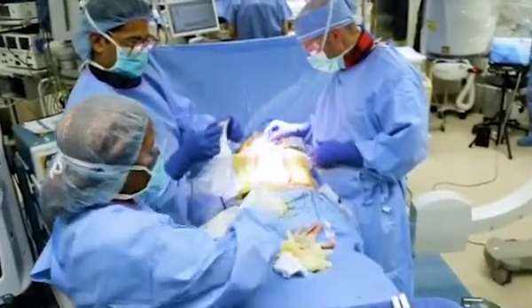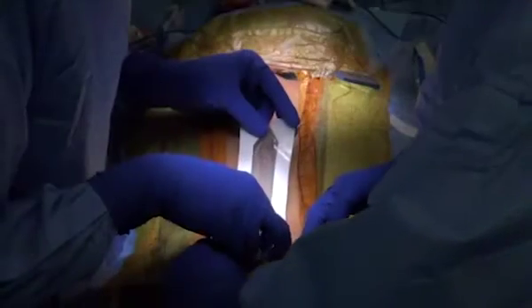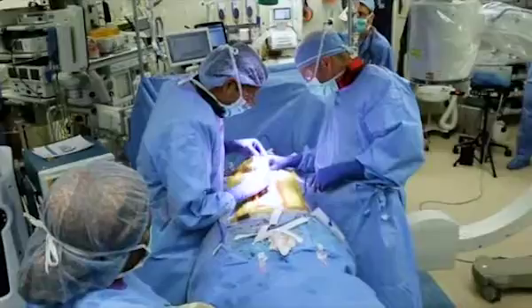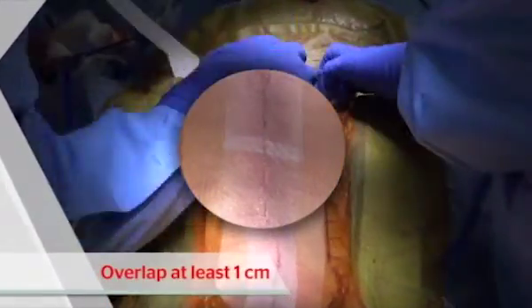Applying Dermagon Prineo is very easy. You remove the central window, lay it down at the end of the incision while you re-approximate the wound edges. Then you spread that across the 22 centimeter length and remove the frames to secure it to the patient's skin. When applying two patches that have to overlap at least one centimeter, the wider patch allows better tissue manipulation and re-approximation of the wound.